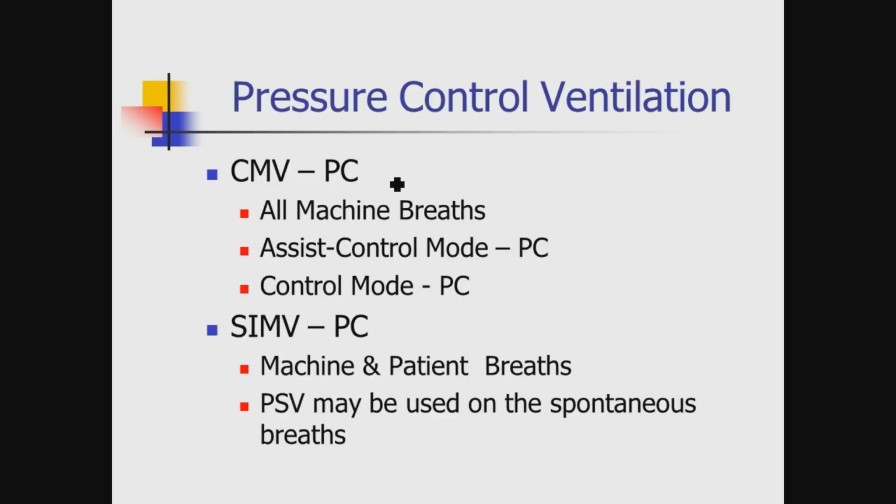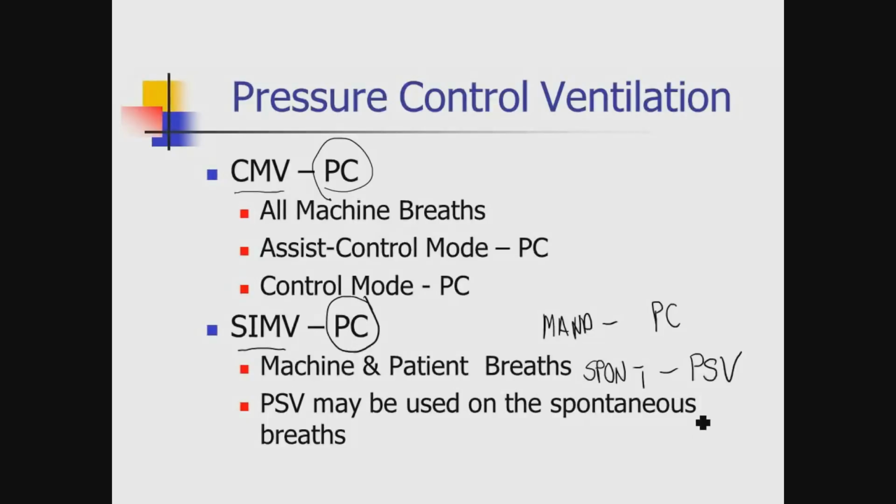So I can have, again, continuous mandatory ventilation with a pressure-based breath. I can have SIMV with a pressure-based breath. I can actually even have the dual mode with a pressure-based breath. In the case of SIMV, my mandatory breaths can be those pressure control breaths, and my spontaneous breaths can be supported with pressure support. Both of these are pressure-based breaths.